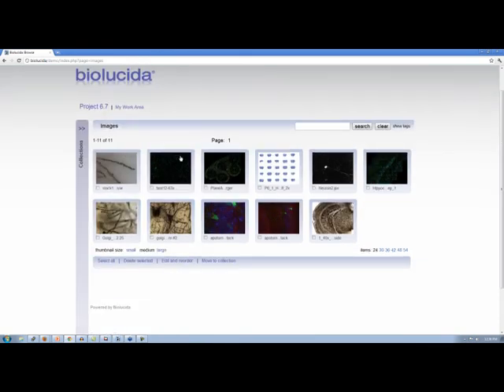I see. Okay. So looking at this new collection you created, it doesn't seem like the order the images are listed in is terribly important since we can see all the images on one page. But in the example where you show that there are many pages of images in one collection, it may be useful for me to have certain images always pop up at the top. Is that something that you can change here? Can you change the order that you see the thumbnails?